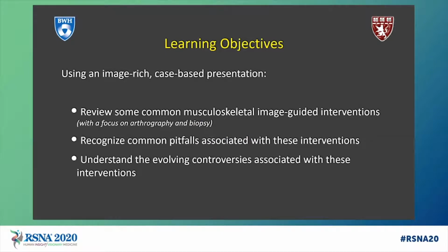So over the next 10 minutes or so, our learning objectives will be to use an image-rich case-based presentation to review some of the more common musculoskeletal image-guided interventions with a focus on arthrography and biopsy. We'll recognize some of the common pitfalls associated with these interventions and understand the evolving controversies associated with these interventions.